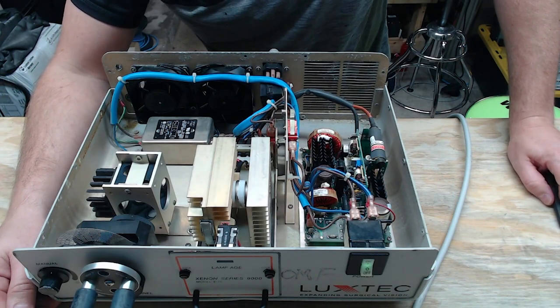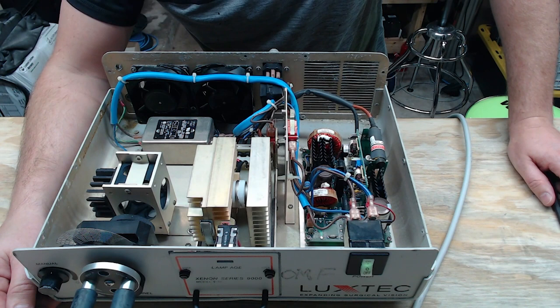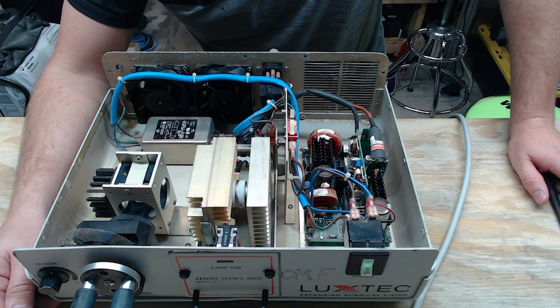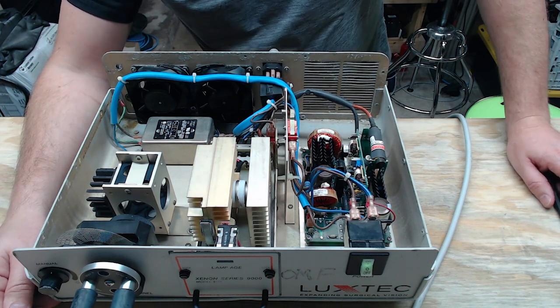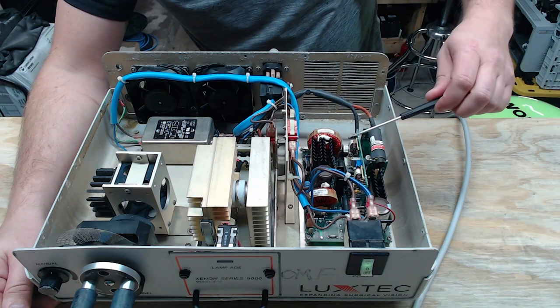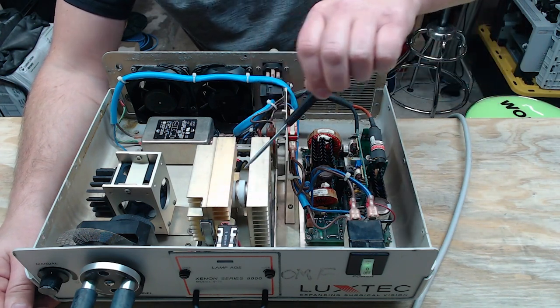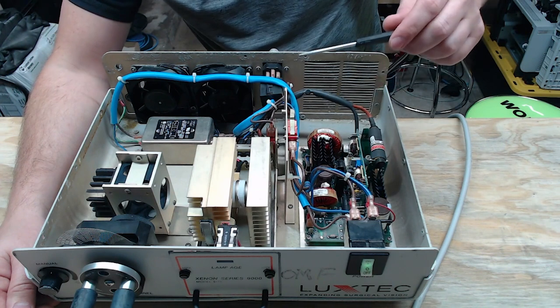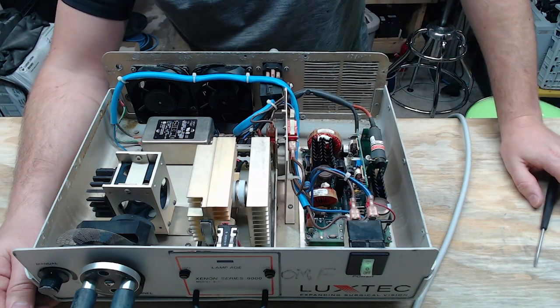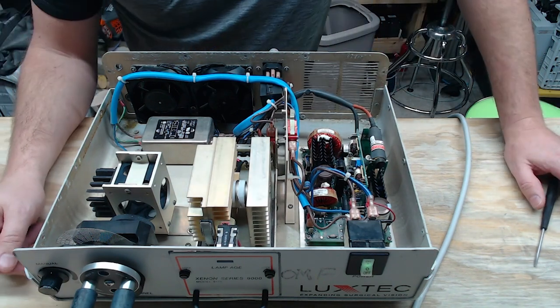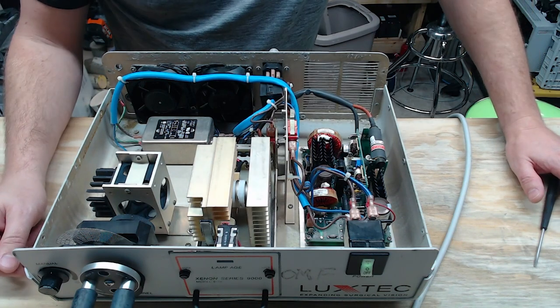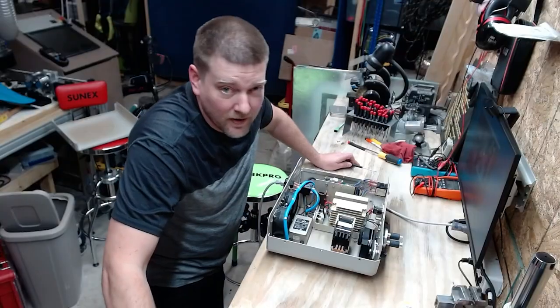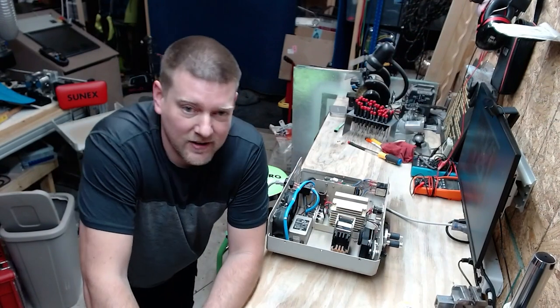And that is pretty much it about these light sources. They're actually a very simple device, but you have to respect them when they're open. This is all technically live, especially if you're going to cheat your interlocks. So be careful, guys. These things can really hurt you and light you up if you're not careful.